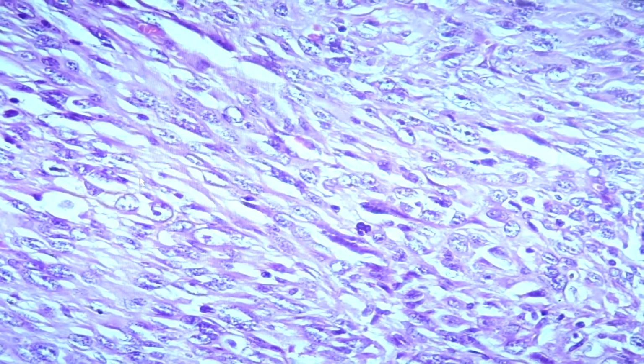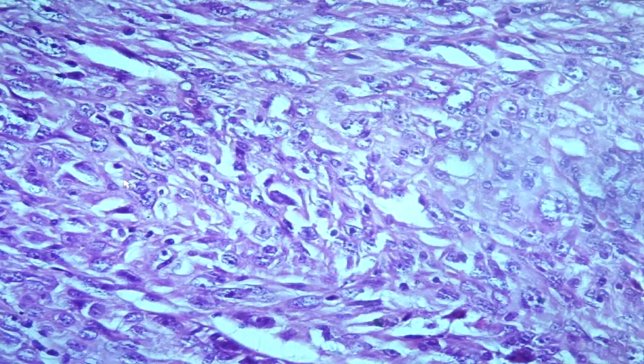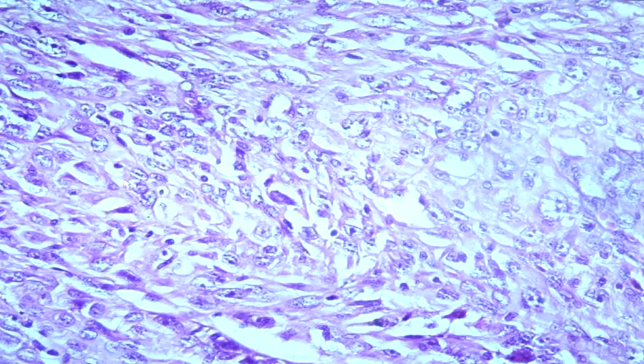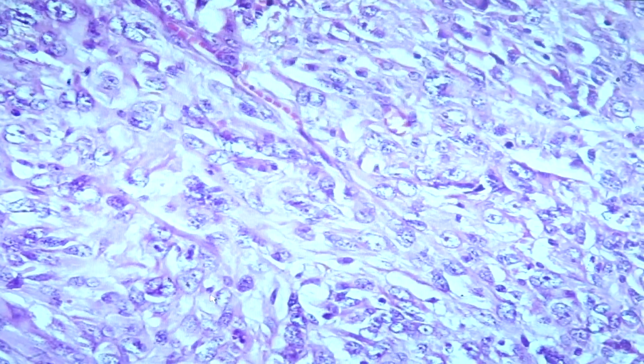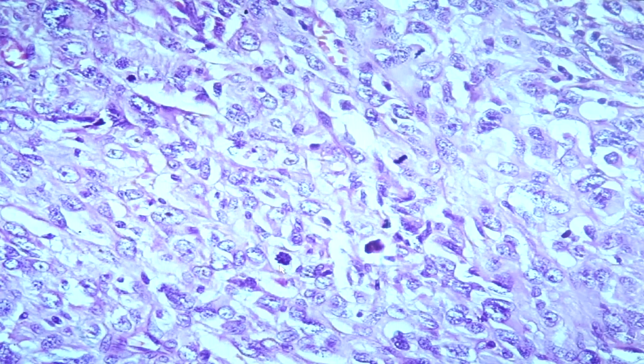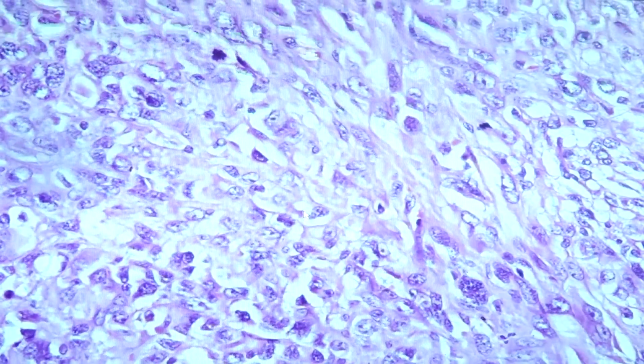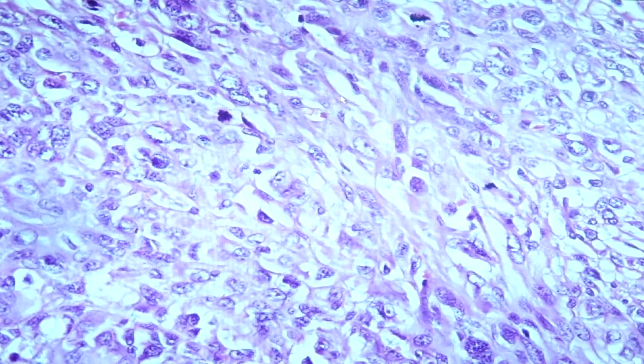You would see a lot of atypia, very prominent pleomorphism of the nuclei. You can have prominence of the nucleoli. Here you can see the presence of pleomorphism. You have mitosis over here, as well as here and this one. So you have a lot of mitosis in this particular case. Here you have mitosis.